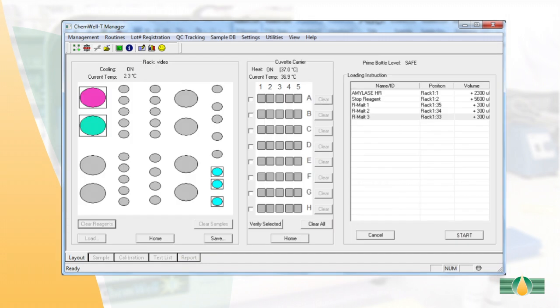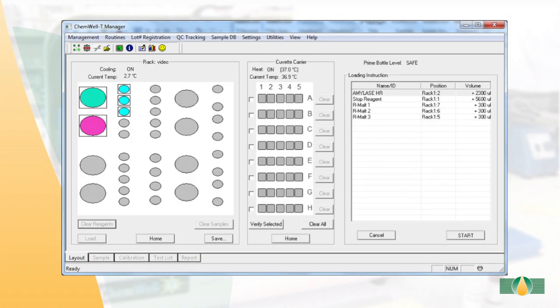The layout tab will automatically open. This represents the layout of the reagent and sample racks and the plate. Positions of the reagents and samples can be modified as required.